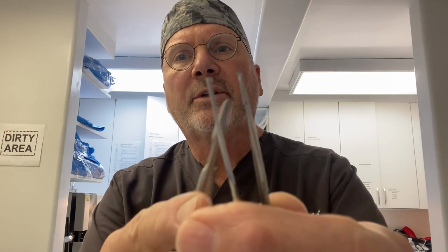So the forceps hand, your non-dominant hand, holds it like a pencil. And if you look close at this one, you'll see that there's a little tying platform. I guess it's coming into focus. There's the tips. This is called a rat tooth Adson. It's a 1x2 Adson. For the points, there's two points on one side and one point on the other side that mesh together perfectly. But back from there, there's a flat metal, slightly rough surface for grasping a needle.